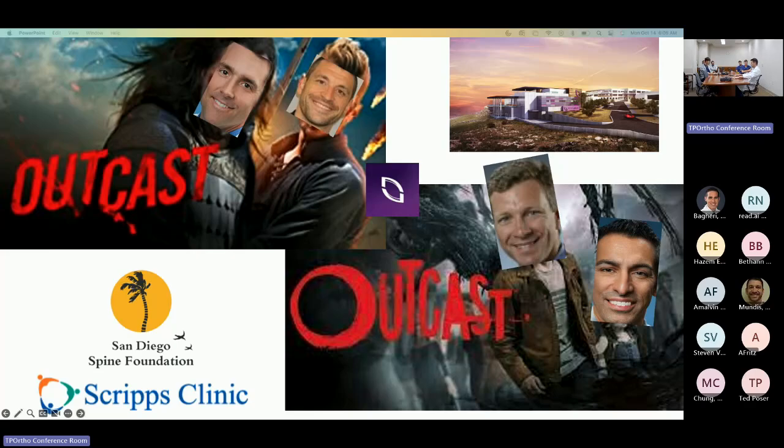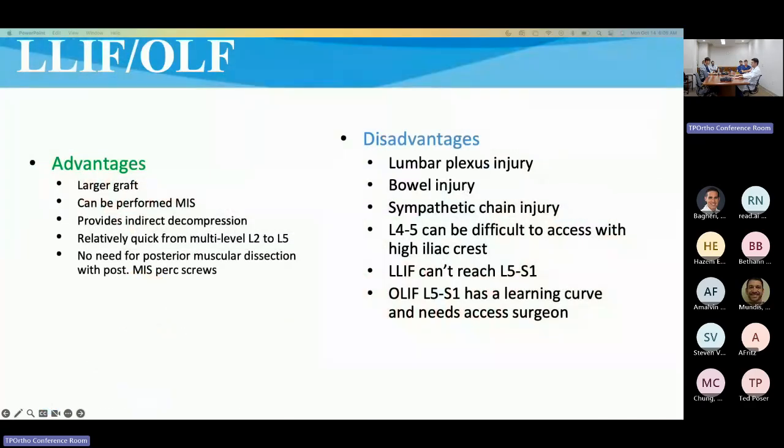So let's go through some of the different approaches and the pros and cons. Obviously here at SCSF, you'll see a ton of lateral, and for good reason. It's an awesome operation. You get a larger graft, it's still MIS. You can do indirect decompression. It's pretty quick. You guys spend an afternoon with Bob, you'll see how quick it can be. You can do multiple levels with one approach. You don't need any posterior dissection other than just your perc screws.